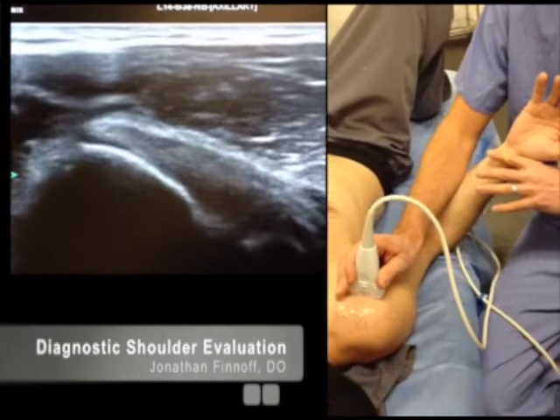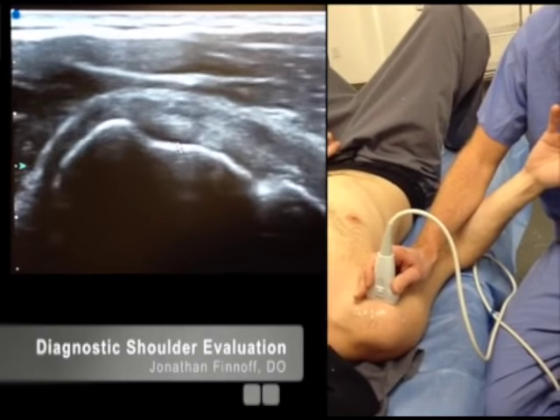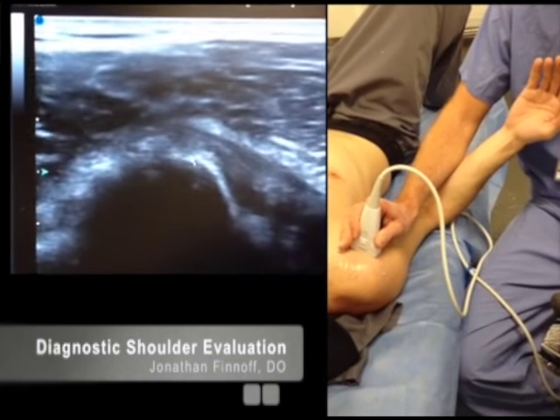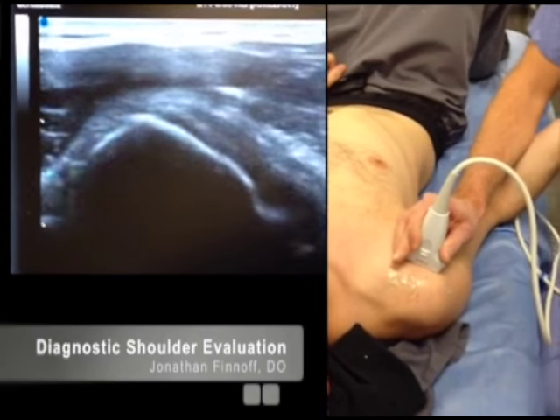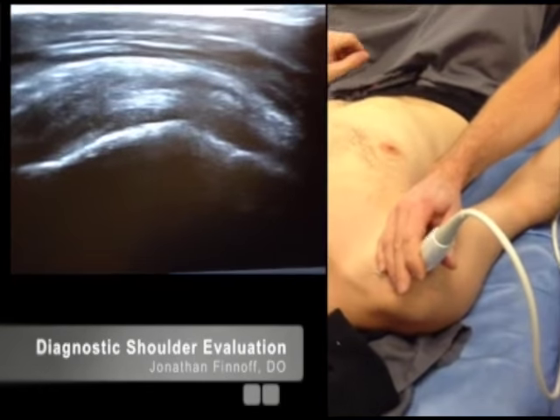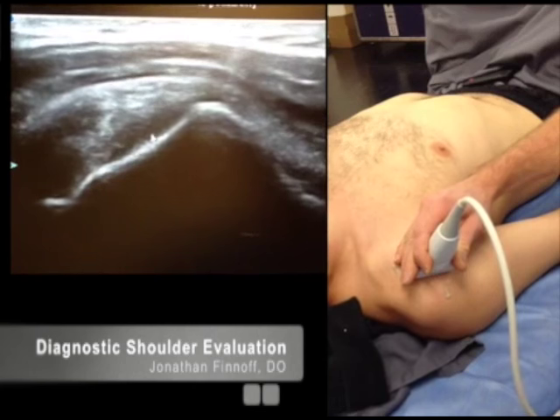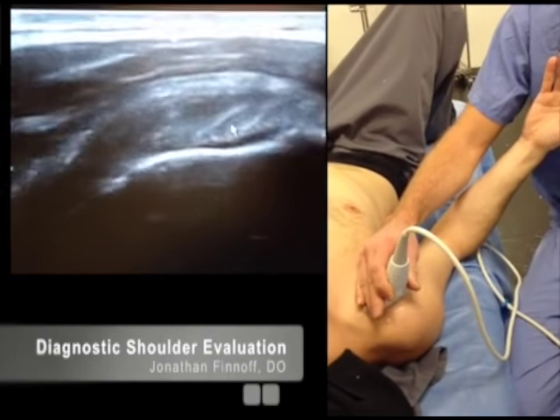Coming over the top medially is your subscapularis. There's your subscapularis tendon on screen right here. I'm going to scan up cephalad along that tendon until I drop off the lesser tuberosity, then scan down caudally to the inferior aspect of the lesser tuberosity, getting the most cephalad and most caudal portions of the subscapularis. After looking at it in long axis, I'll turn my transducer and go over the biceps tendon and bicipital groove, then glide medially. You'll see this pyramidal-shaped bone — that's the lesser tuberosity — and sitting on its cephalad portion is your subscapularis tendon in short axis.